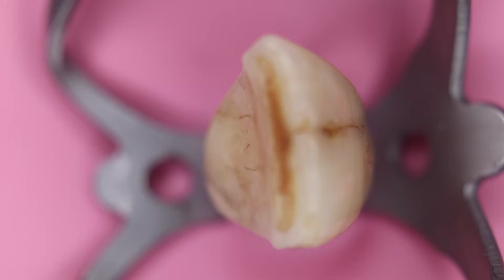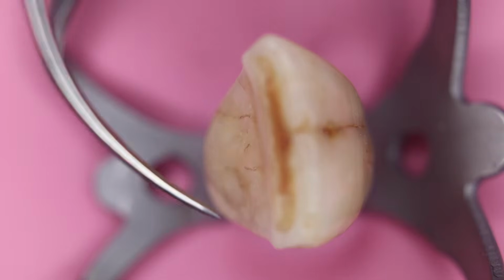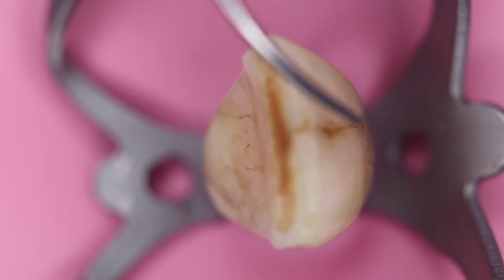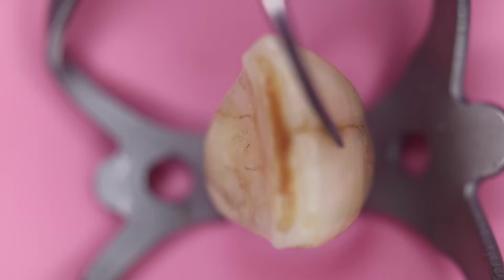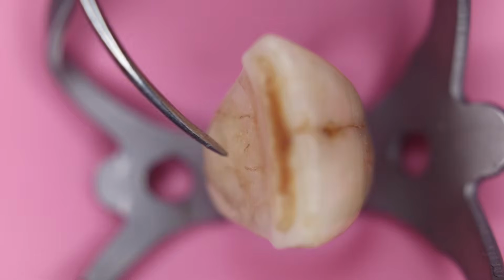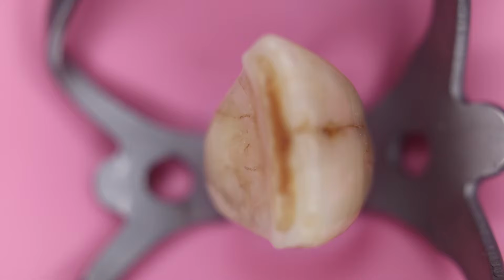The session today, as planned, we have this maxillary central incisor with a treated incisal edge that we can see over here. There is staining on the labial aspect of this central incisor, and we are going to prepare the access cavity. What are the steps involved, and how can we proceed with this access preparation?